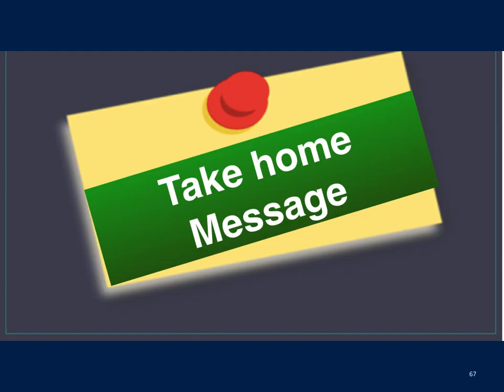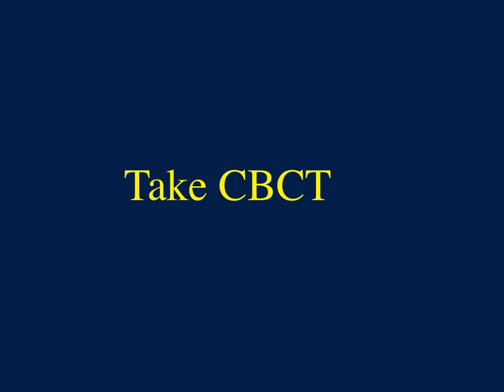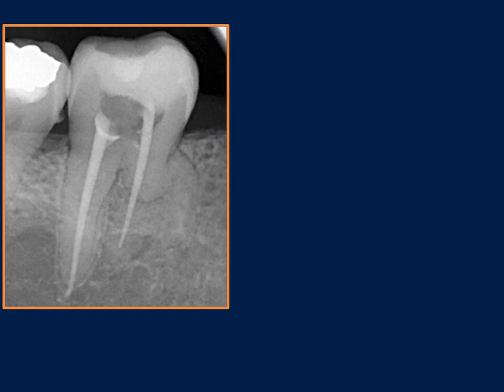So I have a take-home message as a conclusion. When you feel you are confused, lost, unclear, disoriented, you need additional information, you need to know more about this tooth, and you cannot go further without knowing more information, my advice is so simple. Please take CBCT. CBCT will show you the additional information which you need.